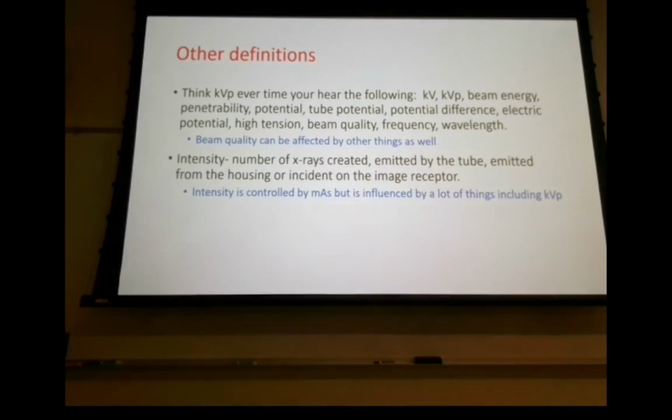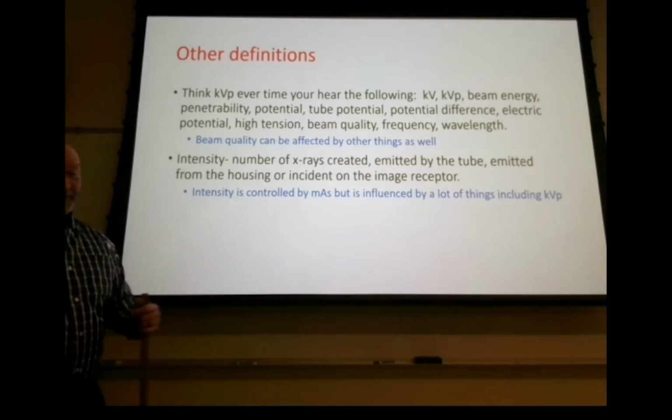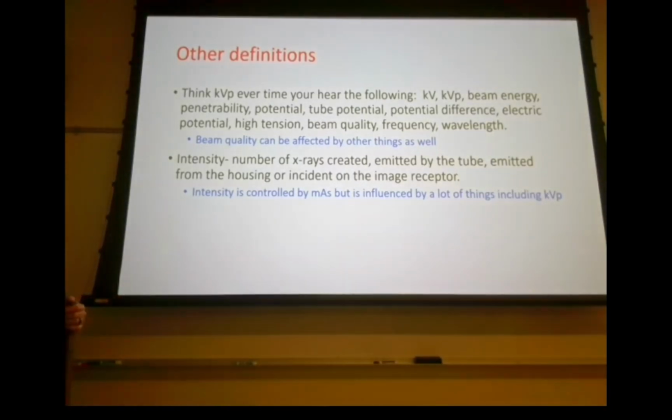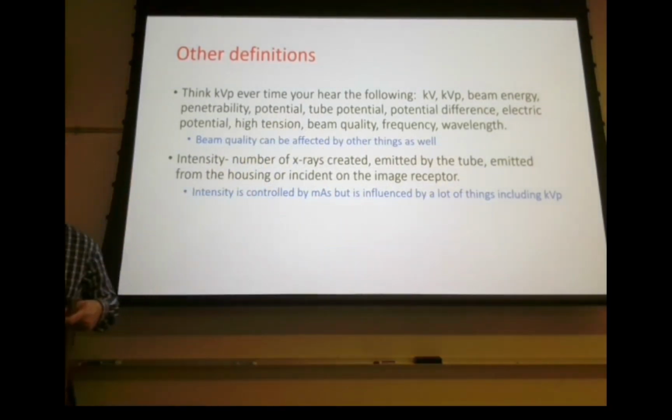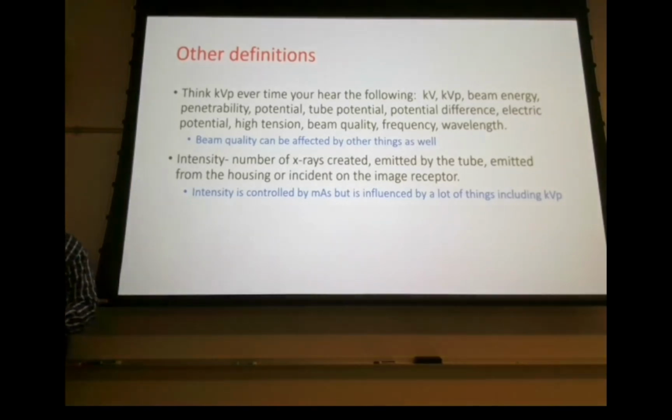So every time you hear kVp, there's a whole litany of things you need to be thinking of. kV equals kVp.